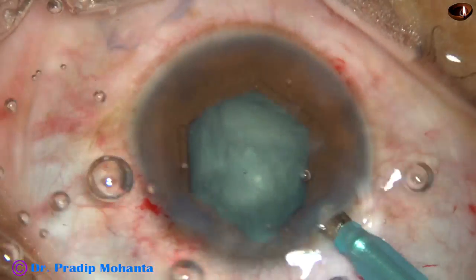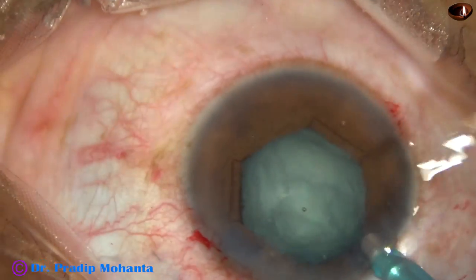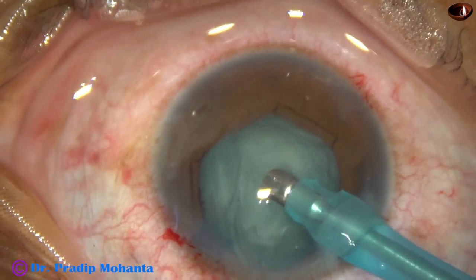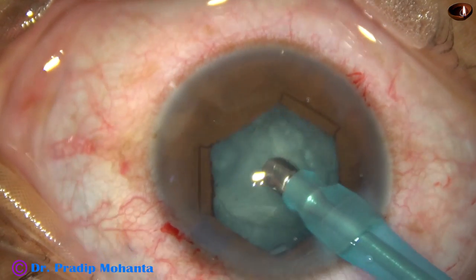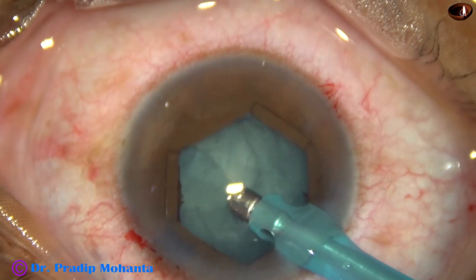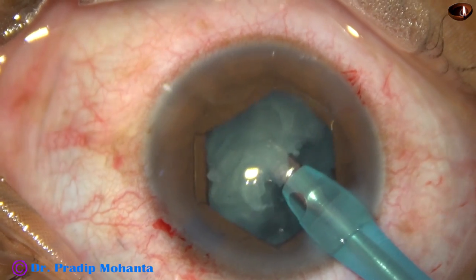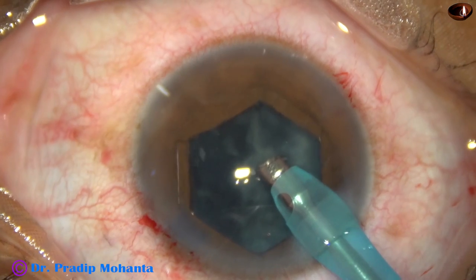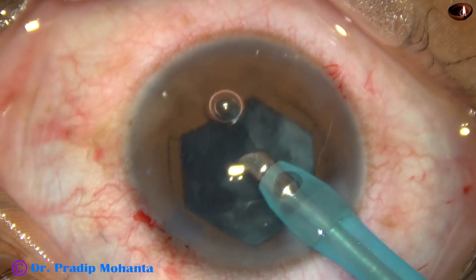Now I introduce the tip of the phaco handpiece, bevel down. This is the dish technique. I apply some vacuum and some lens matter comes. I am very cautious — as soon as the lens matter tumbles, the bevel is turned up so that I don't catch the posterior capsule.